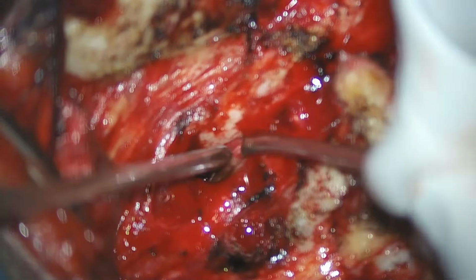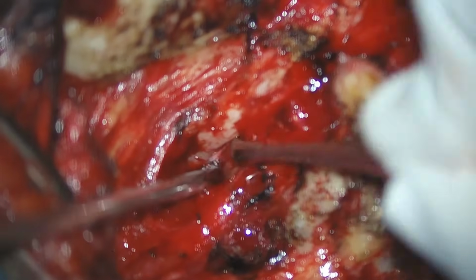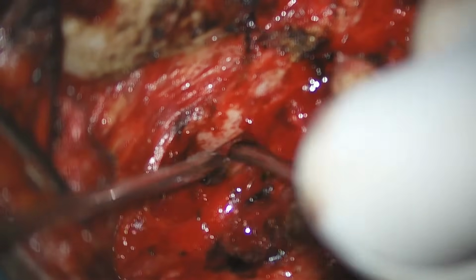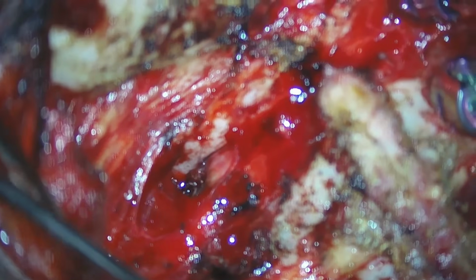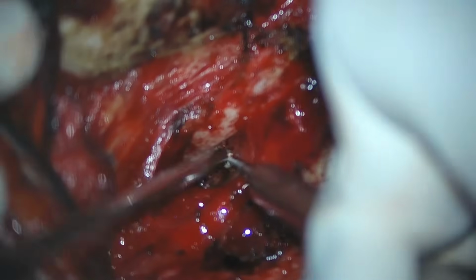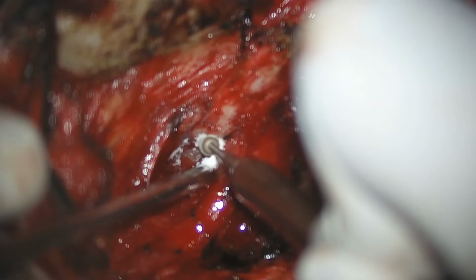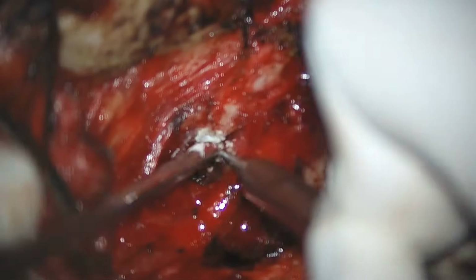Now we can see the C1 posterior arch attachment attaching over the lateral mass. Now this is the entry point where we will slightly drill the posterior arch, and I prefer to put a screw through the attachment between the lateral posterior arch and the lateral mass. In this way we can easily avoid any further dissection, and we can also save the C2 ganglion.